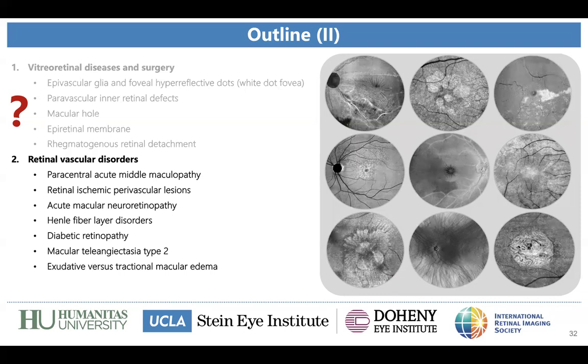Awesome, thank you. I have a point to add to this discussion. I'm really a fan of real life studies, and we know that every diagnostic method has failures, and we have learned a lot with OCT and angiography about how to handle artifacts.